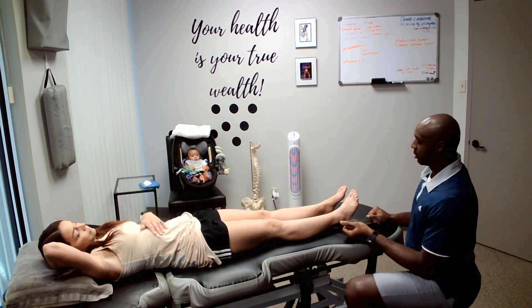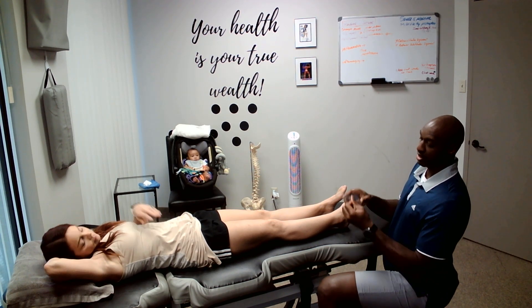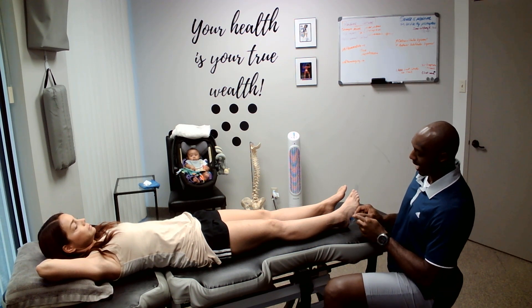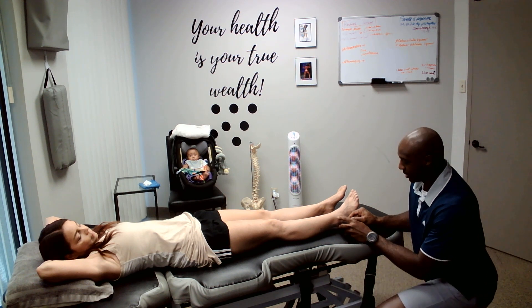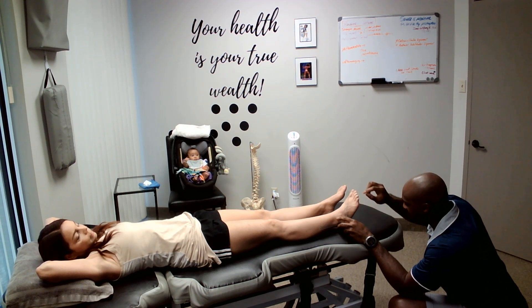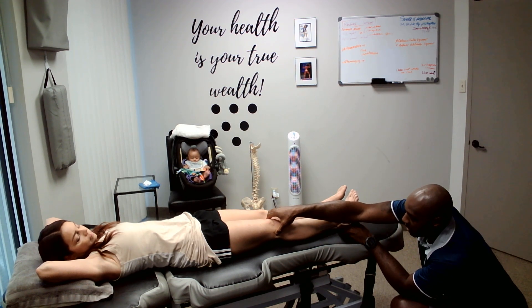The first thing I'm going to do is take my goniometer. I'm going to take the stationary arm, and the axis is going to go through something called the malleolus. So I'm just going to place the axis just like that, and I'm going to have this point towards your lateral condyle. The next thing we're going to do — the knee is going to be here.